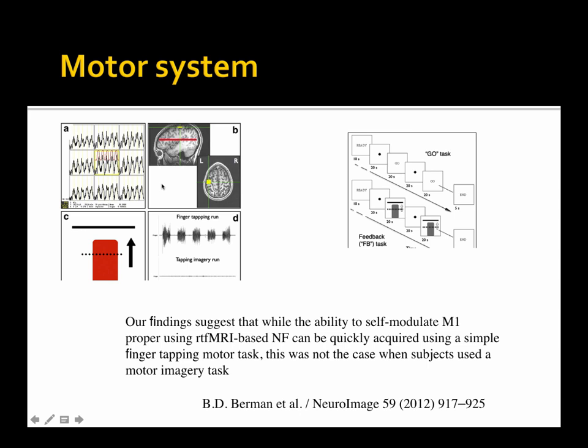As I mentioned before, we also ask the subject to do the same with imagining, so this won't be happening, this will be flat. And we see that the subjects can modulate the network, but the motor cortex per se would not be activated during the imagining, which makes sense because you could activate the whole network, but the output should not activate, right?